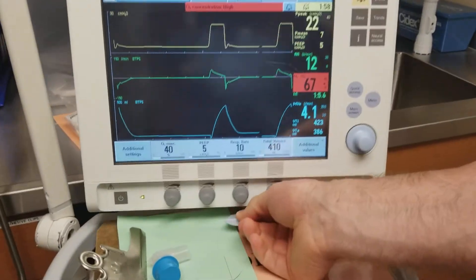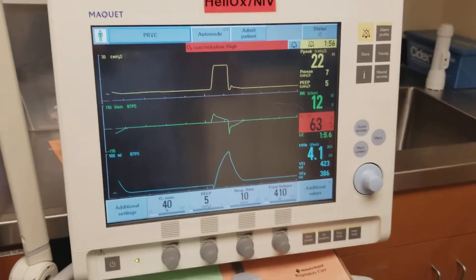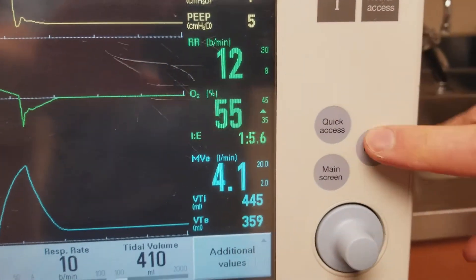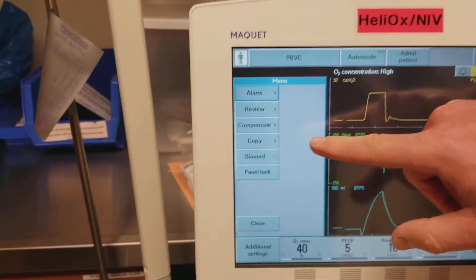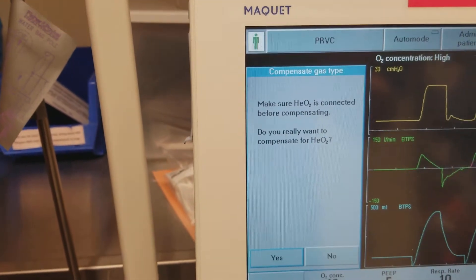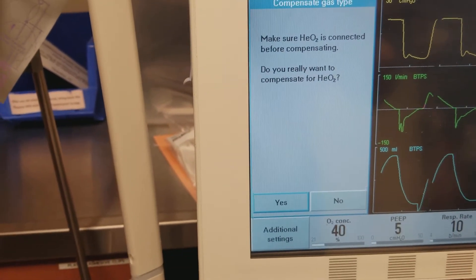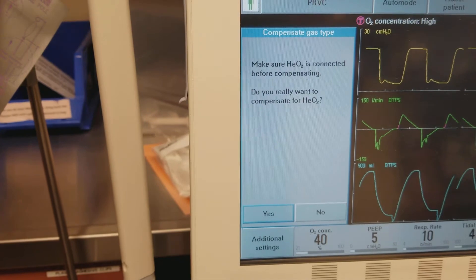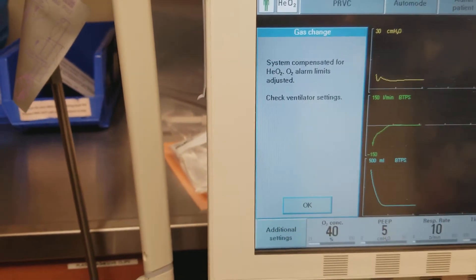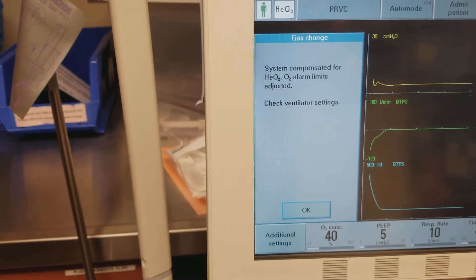We do have one more step: you need to tell the ventilator that we have made the switch to helium. To do that, press the menu button, come over here to Compensate, compensate for gas type. There's a message that says make sure the helium is connected before compensating — and it is — so we'll say yes.